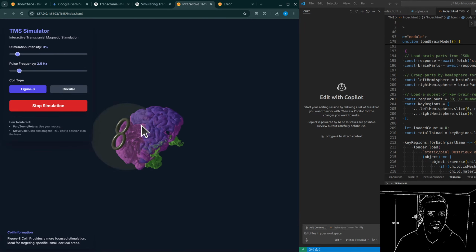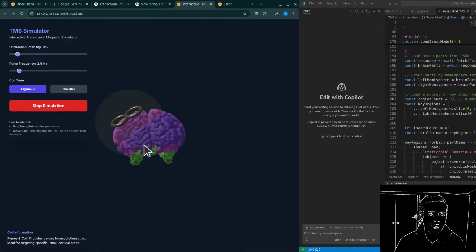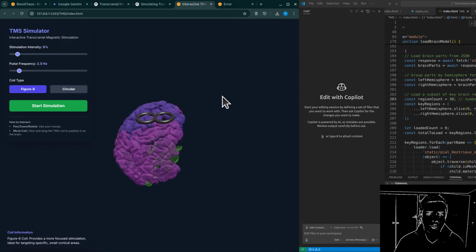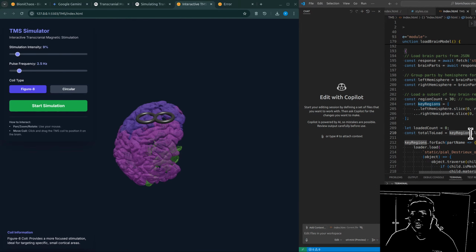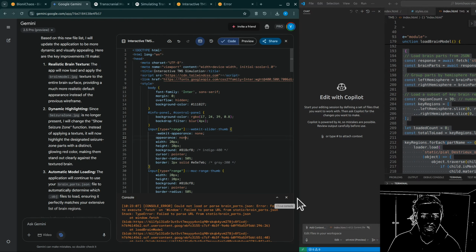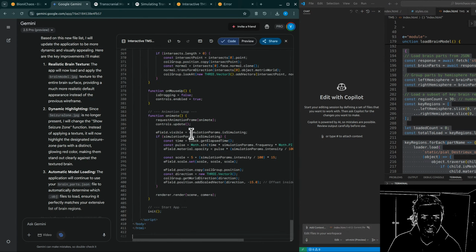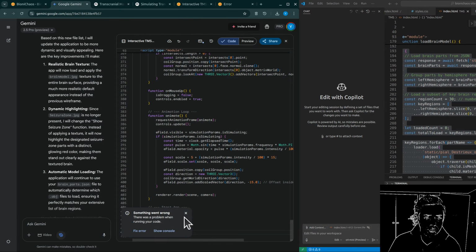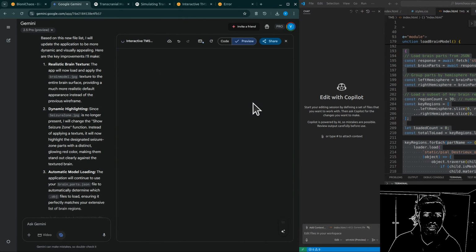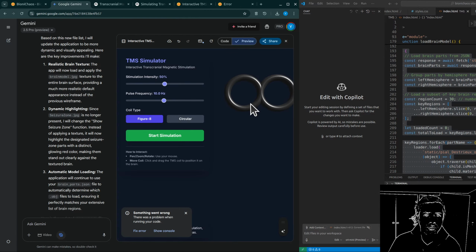Well, for instance, researchers frequently correlate the strength and the location of the simulated E field in the motor cortex with experimentally measured MEPs, those muscle twitches we mentioned. Oh, okay. If their simulation predicts a strong E field in the hand area of the motor cortex, and they actually measure a large MEP in the corresponding hand muscle when they stimulate that spot in reality, then it gives them confidence that the model is doing something right.